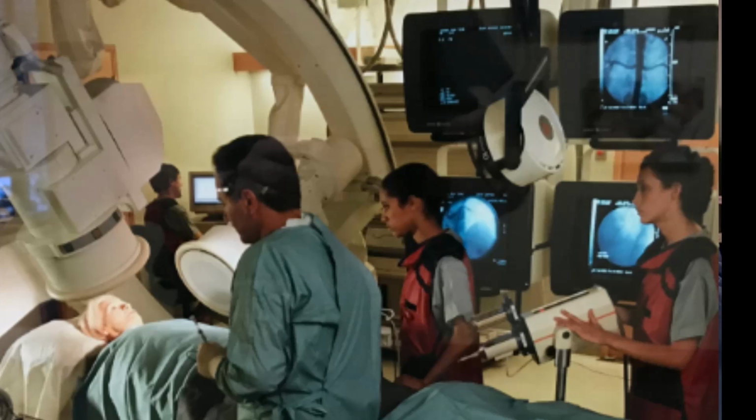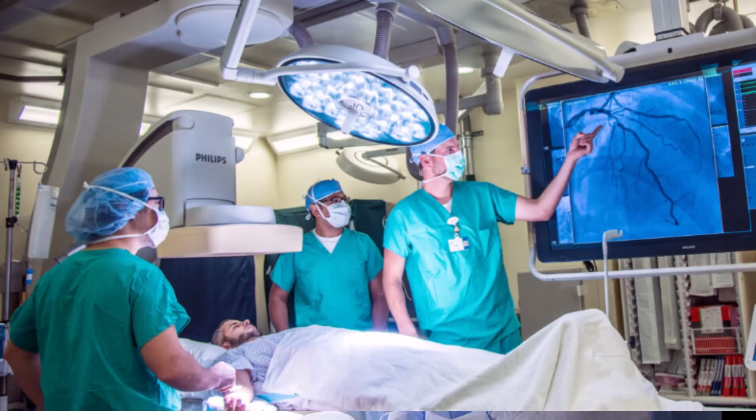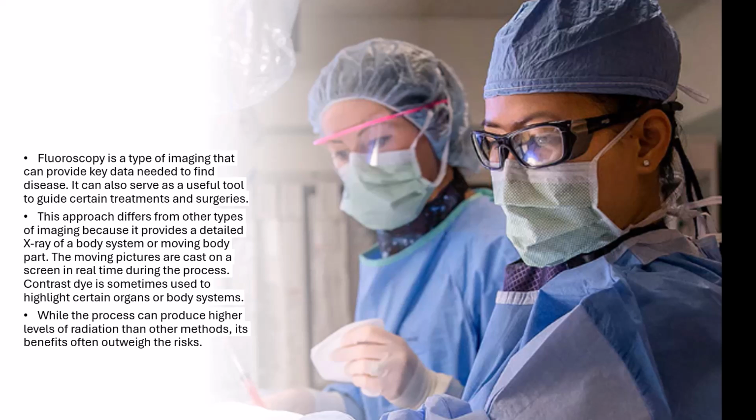This approach differs from other types of imaging because it provides a detailed X-ray of a body system or a moving part in real time. The moving pictures are cast on a screen in real time during this process, and you can use contrast or dye to sometimes highlight organs or body systems. While the procedure can produce higher levels of radiation than other methods of imaging, its benefits often outweigh its risks.